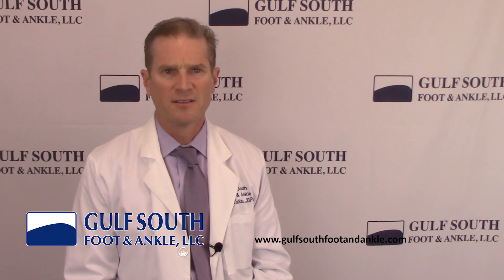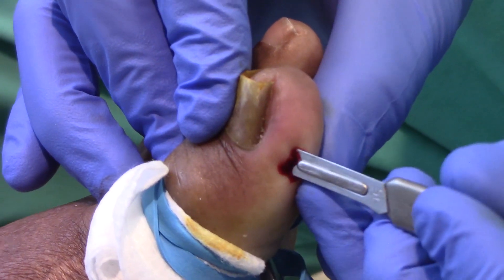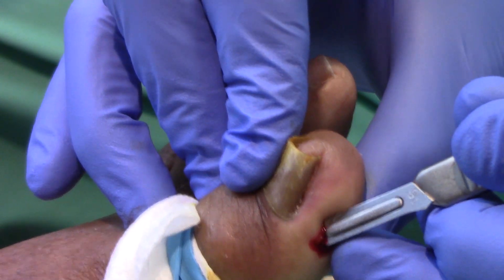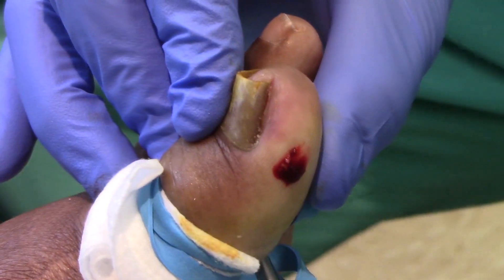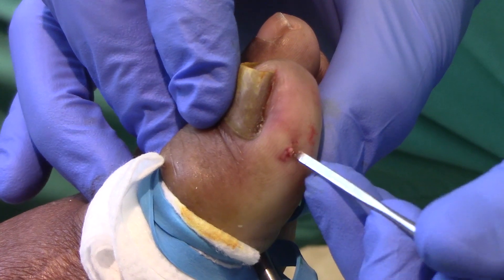Following a small injection to numb the toe, application of the KD device begins with a small incision on each side of the toe. Through the incision, the nail root or matrix is released from the underlying tissues. At this point, a small tissue flap can be rotated under the matrix to assist with holding the nail in place.